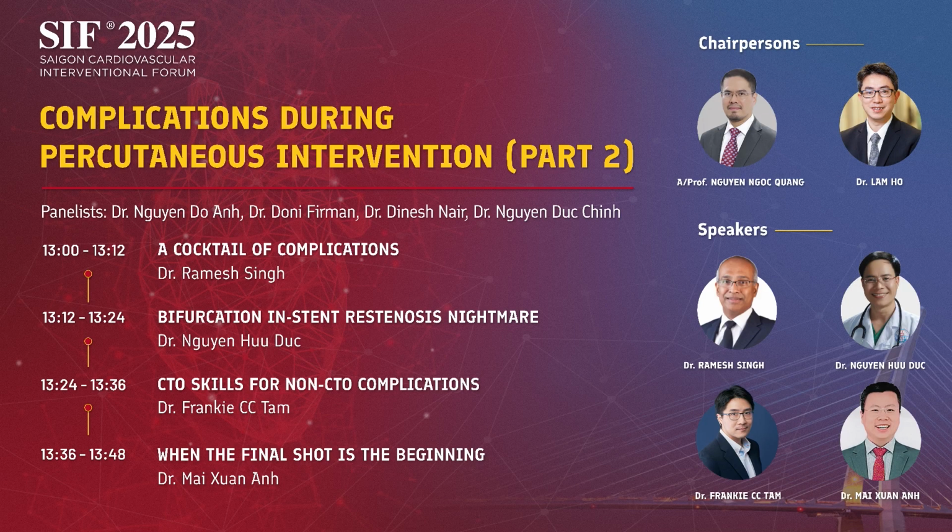Yeah, hold on. I have another opinion. In my hospital, I have a very good system. Before I do the complete PCI, usually I give the patient a CT first, and I have a good plan. If the diagonal is very calcified, it's easy to rupture. Maybe I will try to stent it simply.